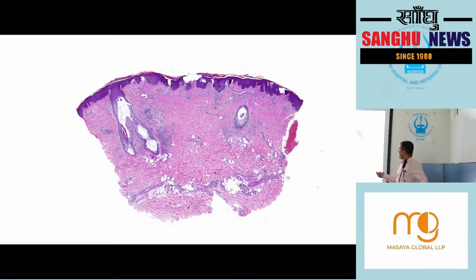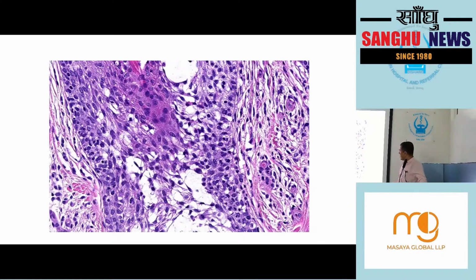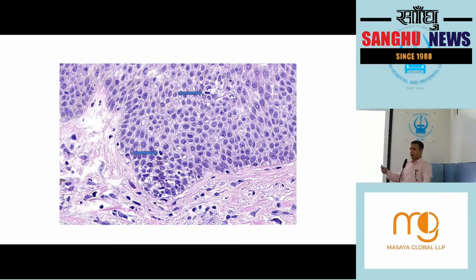See, a very subtle lesion looks like in this part. I see some collagen between two hair follicles. Closer view, I see some spongiosis. That's why the diagnosis of spongiotic dermatitis was made, because of this edema, this spongiosis is the reason why. But I see some lymphocytes, they have broken this muscle also, arrector pili muscles. Spongiosis in closer view. And I saw, are there any atypical lymphocytes?